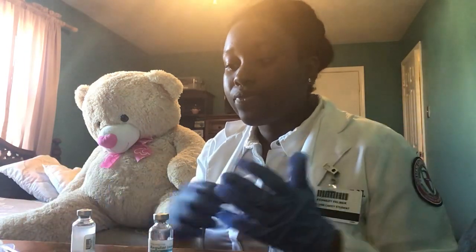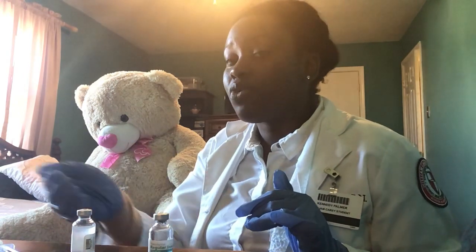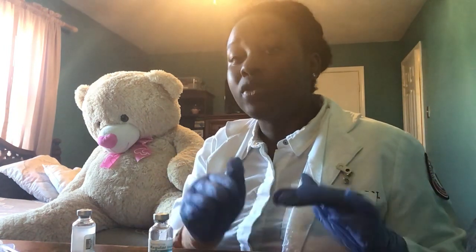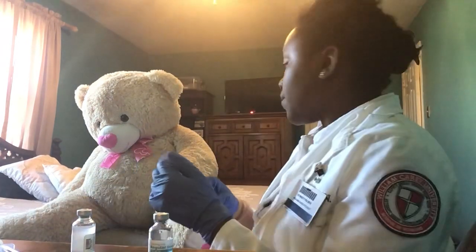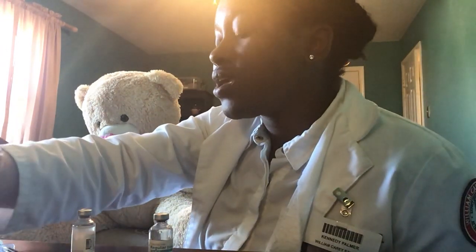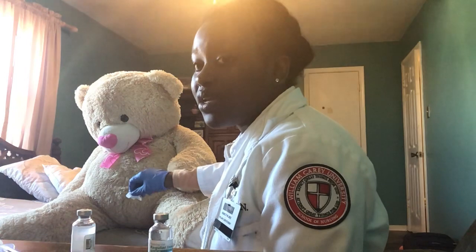If I was not in the room with the patient, then I would label the syringe before walking to the patient's room. And now I'm just going to verify the physician's orders along with the MAR before I give the medicine to the patient again. Okay. And so I'm going to take an alcohol swab and I'm going to wipe the site that we're going to use, which is going to be 2 inches away from the umbilicus.